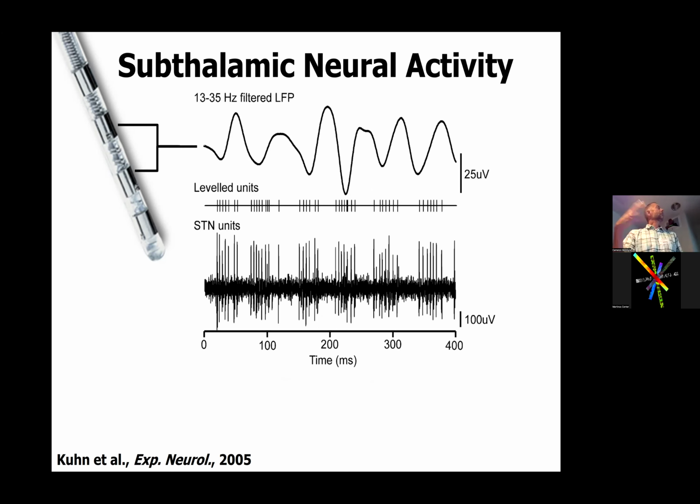But the field wants to understand, well, what is creating these waves? The waves are coming from the firing of individual neurons and their synaptic inputs. And you can line that up and see that when the neurons are firing, you get these negative deflections, and when the neurons aren't firing, you get these positive deflections, and so on and so forth. You could do that in the operating room.